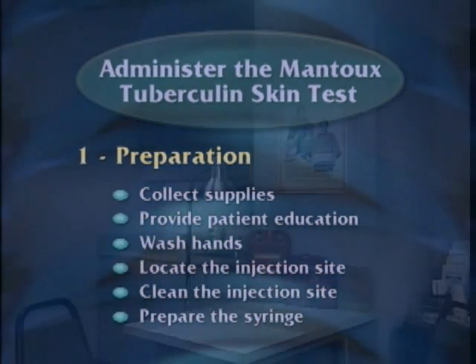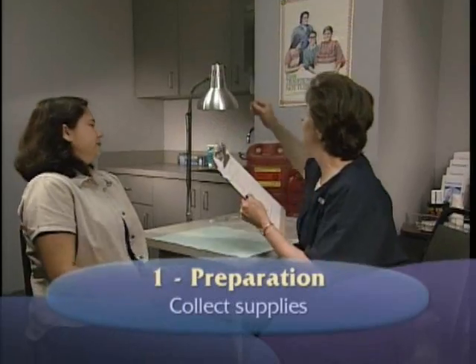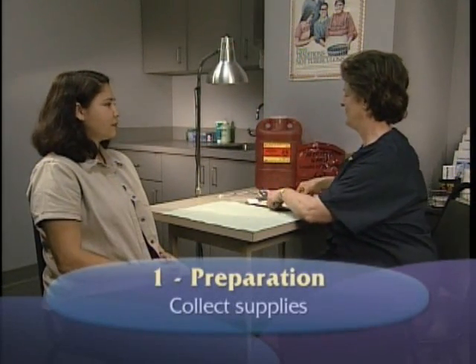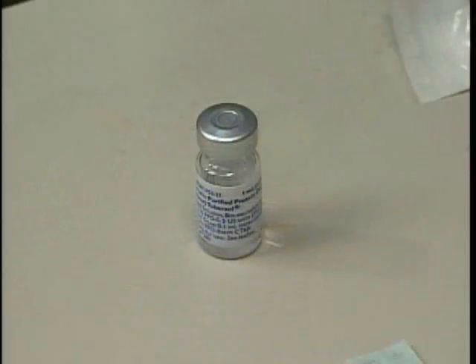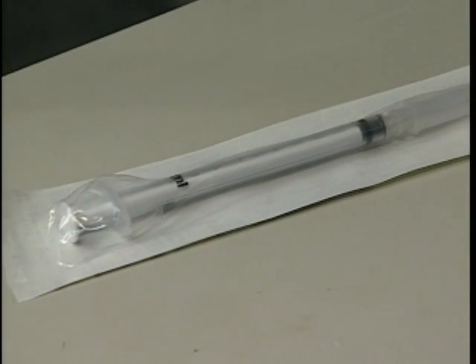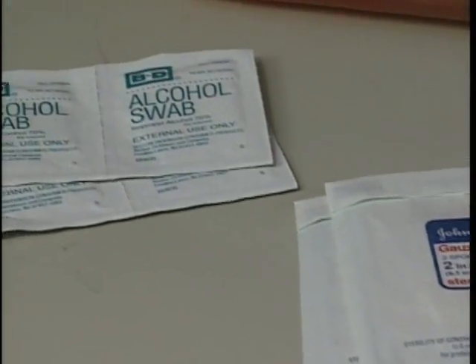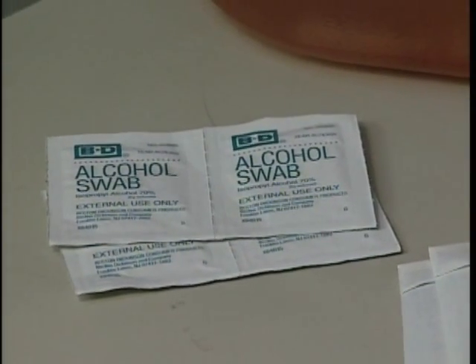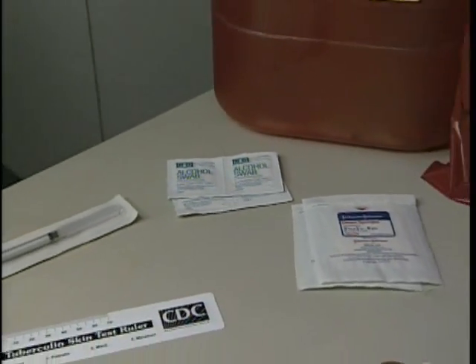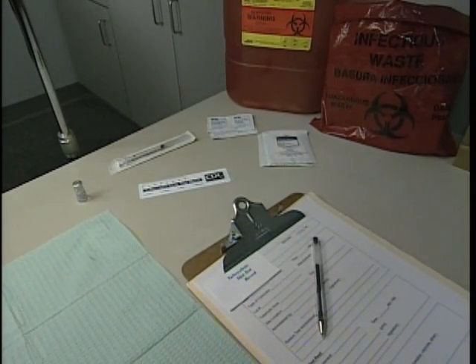When preparing to administer the Mantoux tuberculin skin test, make sure that the area for administering the test has a firm, well-lit surface and that equipment and supplies are ready. Supplies should include a vial of tuberculin, a single-dose disposable tuberculin syringe, a ruler with millimeter measurements, 2x2 gauze pads or cotton balls, alcohol swabs, a puncture-resistant sharps disposal container, record-keeping forms for the patient and provider, and a pen.